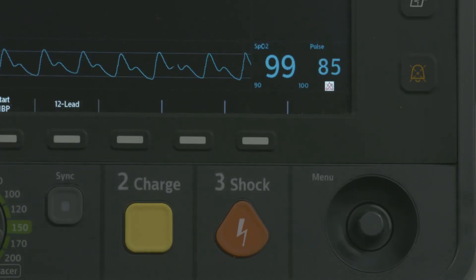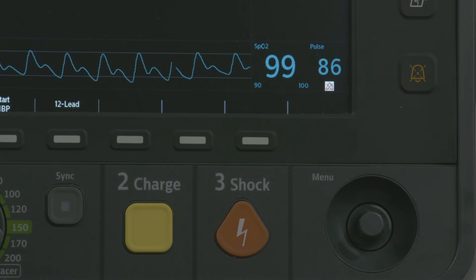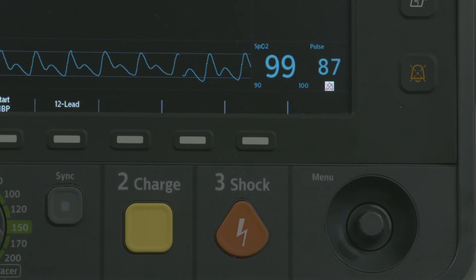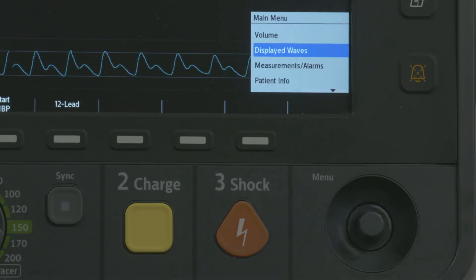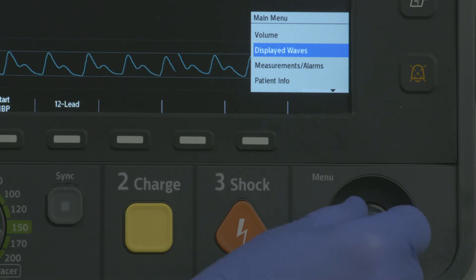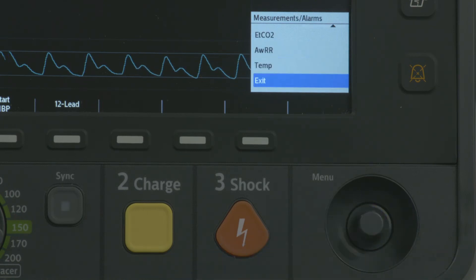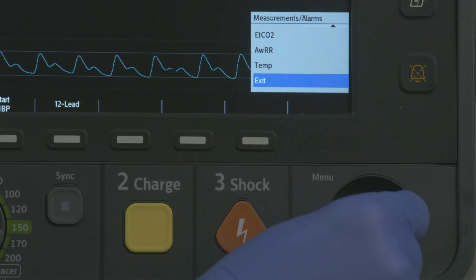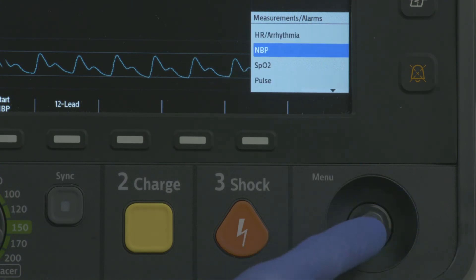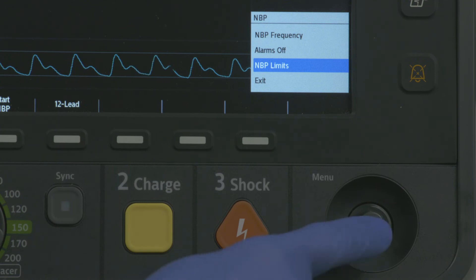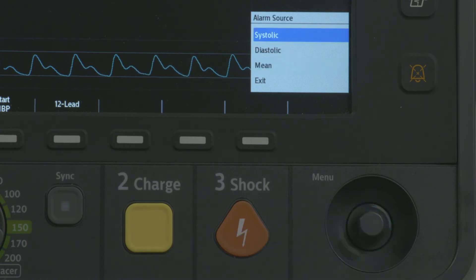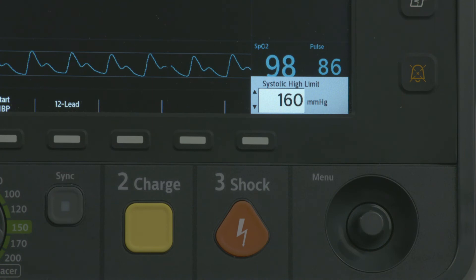Setting high and low alarm limits and turning alarms on or off is the same for all measurements. Using NBP and SPO2 as examples, to set the high and low limits, press the SMART SELECT knob. Use the SMART SELECT knob to highlight and select MEASUREMENTS ALARMS, then NBP, then NBP LIMITS, then SYSTOLIC, and press the SMART SELECT knob.